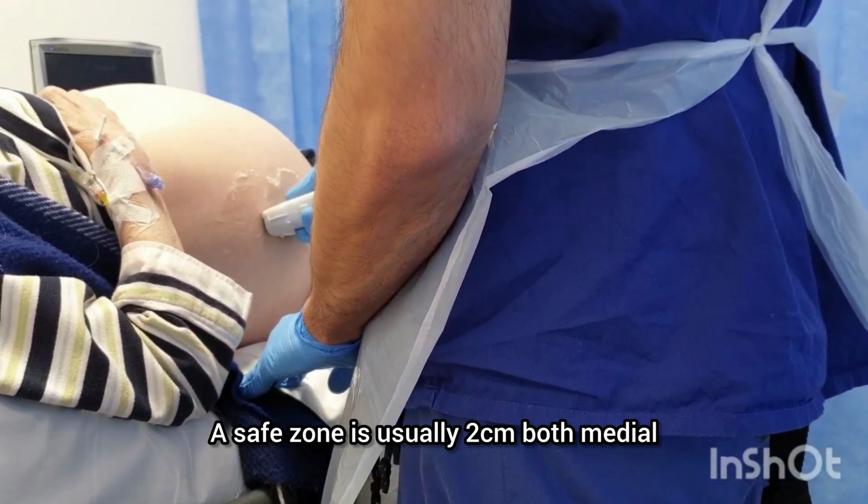Now, you will thoroughly clean the ipsilateral hemiabdomen where you plan to insert the drain. Use 2 ChloraPrep sticks and allow for the chlorhexidine alcohol solution to dry before proceeding to the next step. Now to administer your local anesthetic. Good anesthetic efficacy will make the procedure easy for you and keep your patient at ease.